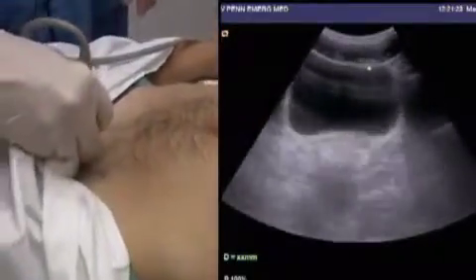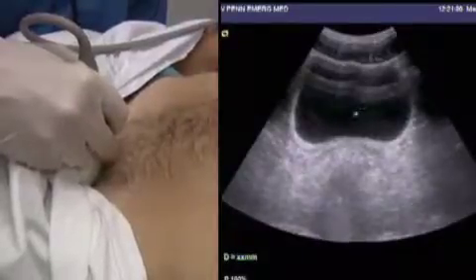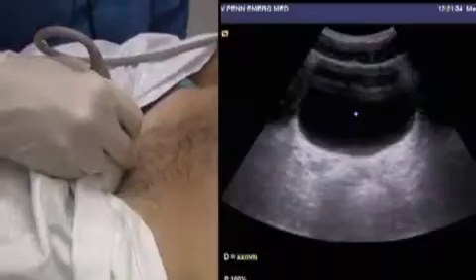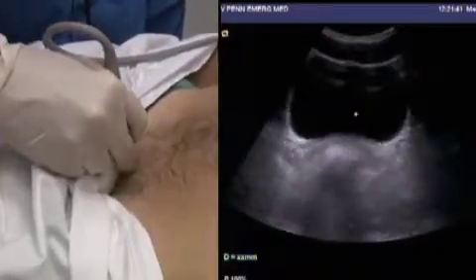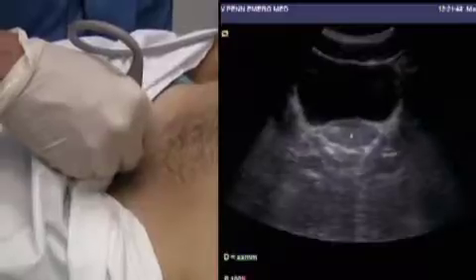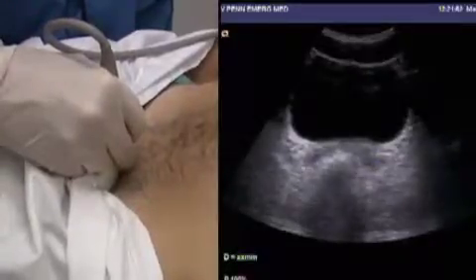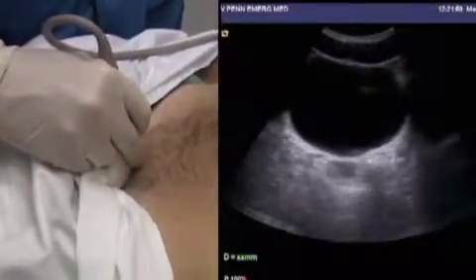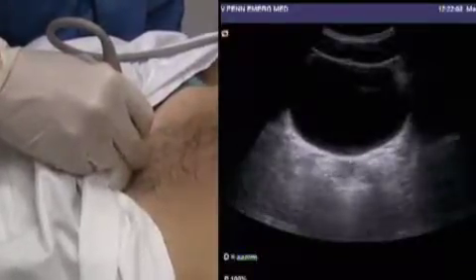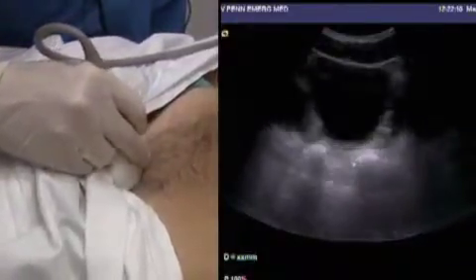Moving on now to the suprapubic region. The probe is slid down all the way to touch the patient's pubis. On the screen, the bladder can be seen here. Gain usually needs to be diminished here to bring out the structures behind the bladder without being washed out by a gain artifact. We start as low as we can, find the prostate, and scan north in the transverse plane. Right above the prostate, we find two symmetrical round hypoechoic structures — these are seminal vesicles, not free fluid. We scan cephalad of them, as this is really the area where we're most likely to encounter free fluid. This structure right here is the sigmoid colon and the rectum, and we scan up systematically to the dome of the bladder. That completes the FAST exam.